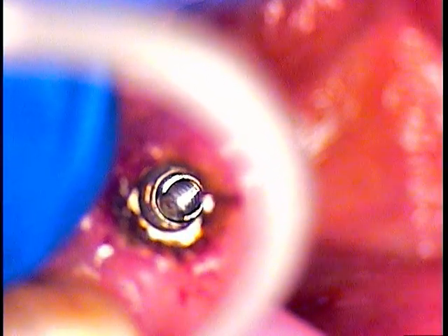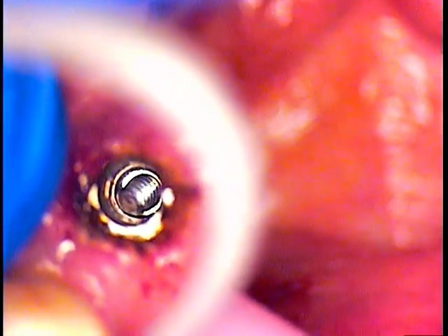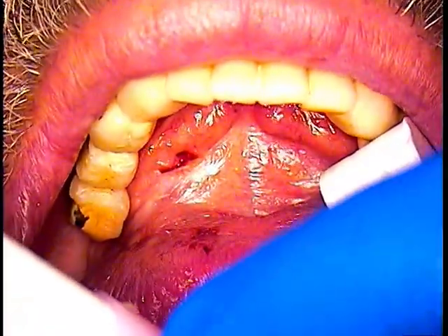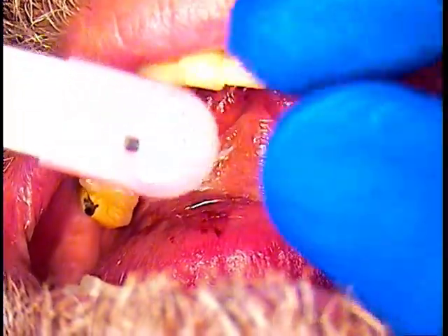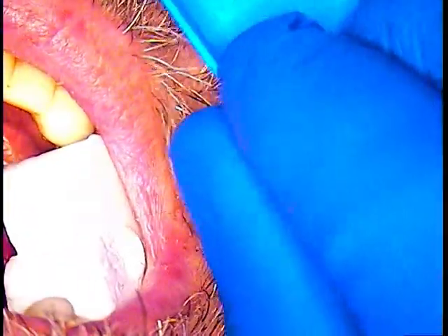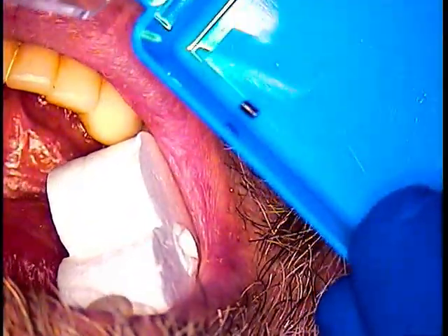And there it is. You can see that now, right? You see how it's just laying there on its side? So this is where my dental assistant is going to put her flat suction tip right on top of that, and it'll end up right in the screen. Just like that. And there it is. You see it right there. That's the piece. She's now going to put that in this little dish and tap it in there. And we now have a prize. There's the first one out. We'll be looking at that in a little bit.